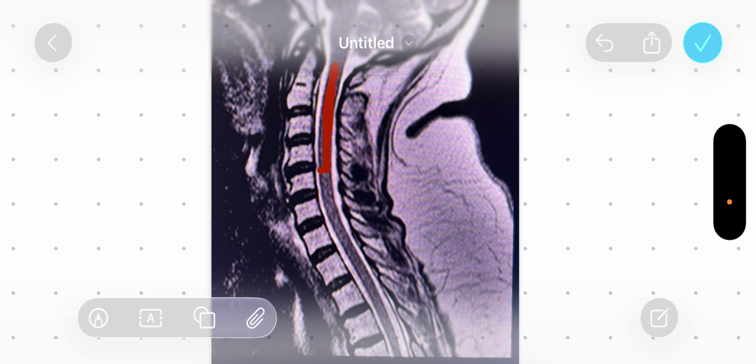Now, the bigger the patient is, the grainier your image is going to be, unless I give it more time, increase the time, right? That's eventually going to create better images, but you're going to be there a longer time, and your SAR is also going to increase more because I have to do continuous scanning of your anatomy.